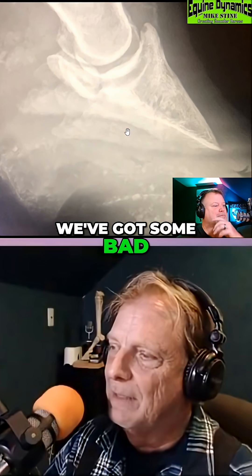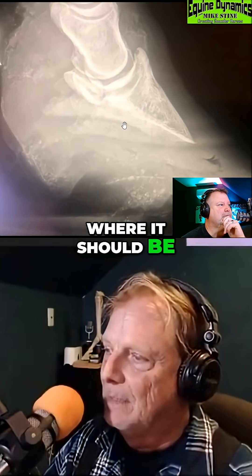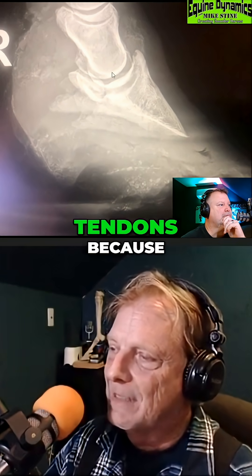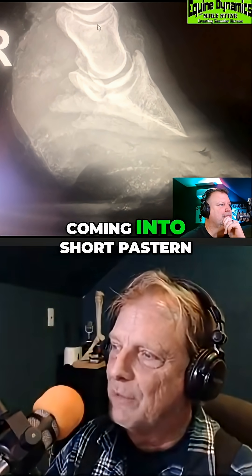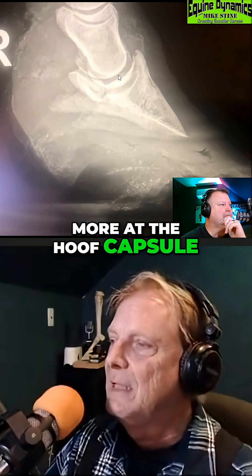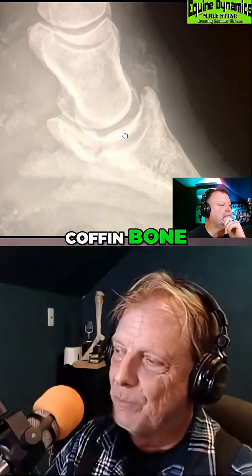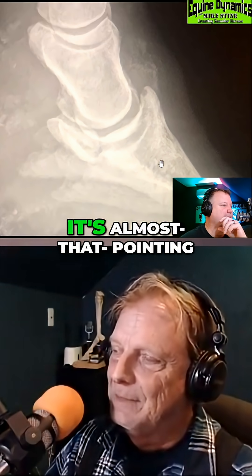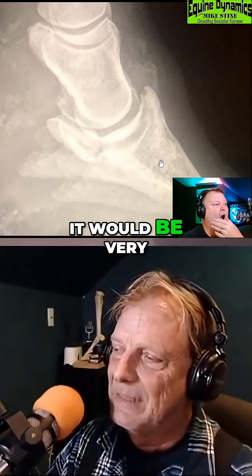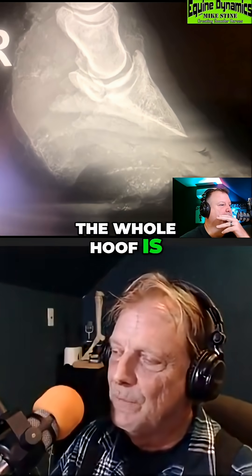We've got some bad bony column alignment — it's not where it should be. You've got contracted tendons. If you look at that long pastern coming into the short pastern, it's broken back at the short pastern, and even more at the hoof capsule. If you line that up with the long pastern, the tip of the coffin bone is pretty much pointing directly down. The whole hoof is so distorted.